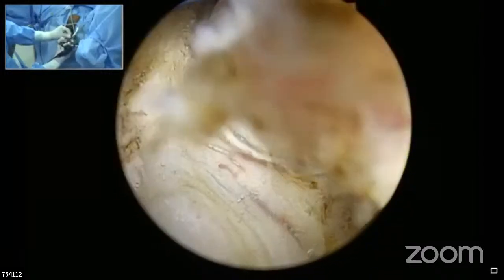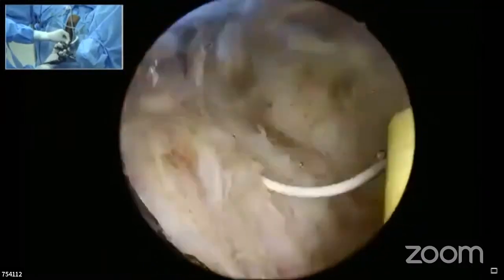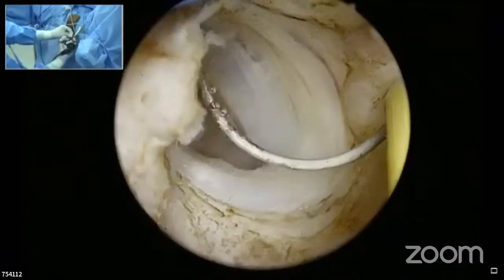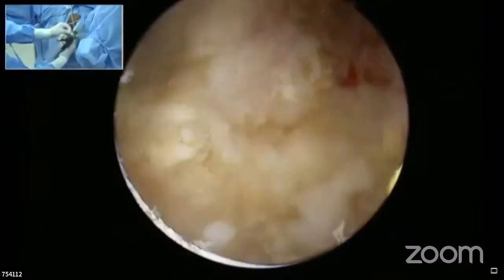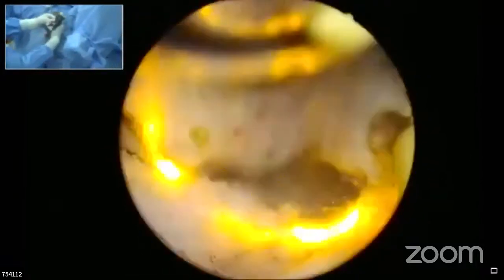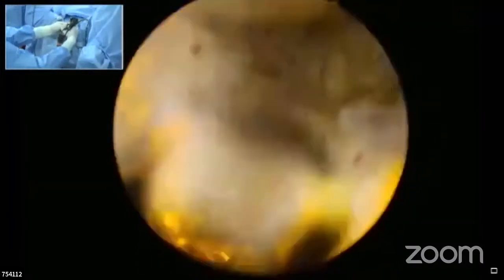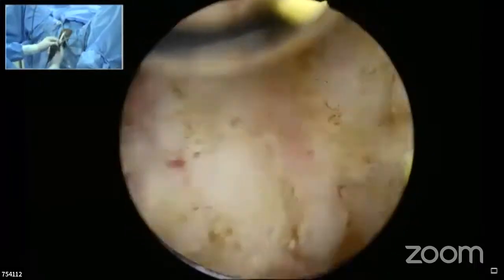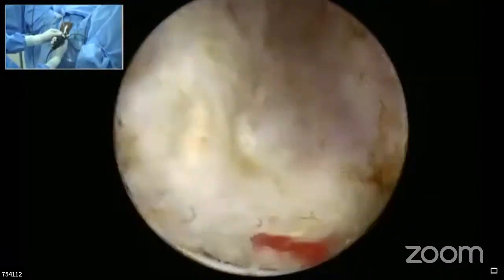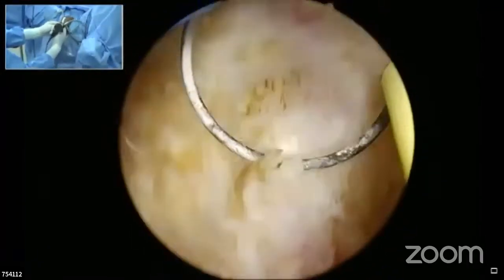That's a perf there. You can see it very clearly. This is a perforation that has happened. Yeah, that's a very clear-cut perf. This is one of the reasons that in large glands, when it extends too laterally, there will be a contraction of the capsule happening, and it tends to move inside much more beyond what you intend to cut, making the cut a lot deeper. This perforation is at the apical area on a lateral side, which is not of such consequence. But if this opened into a sinus, what would you do now?